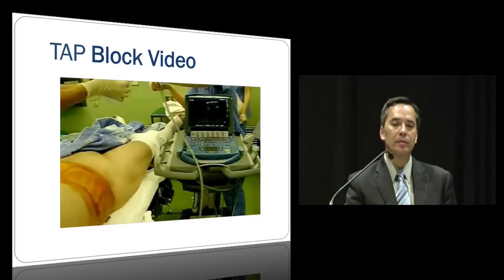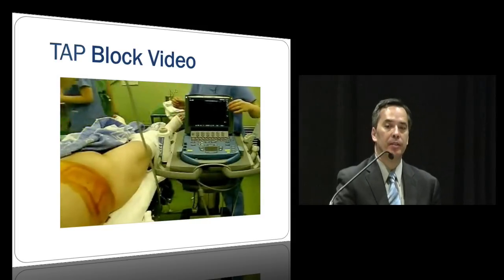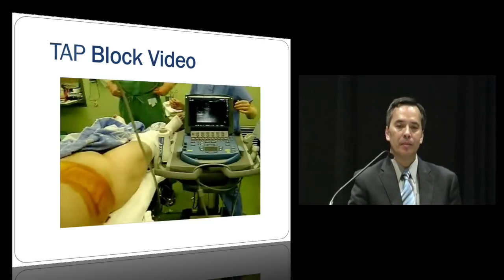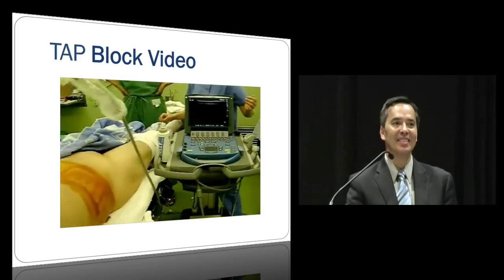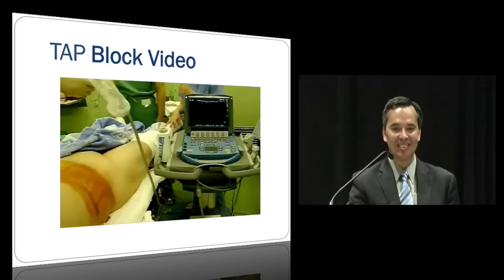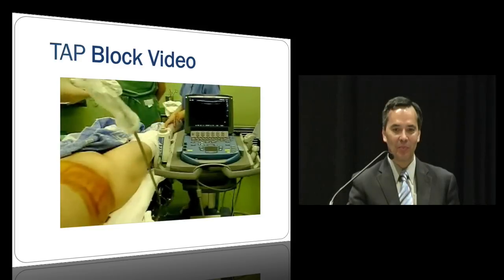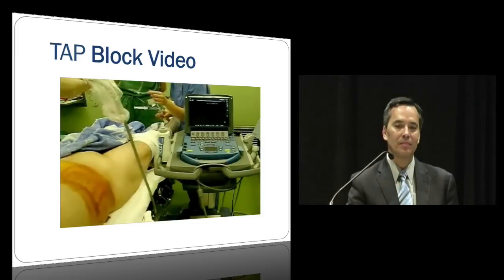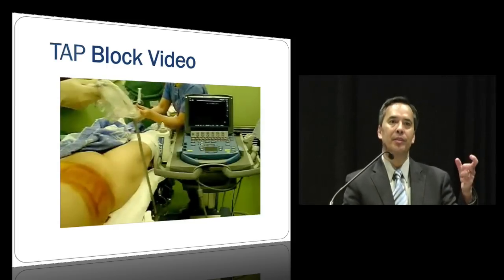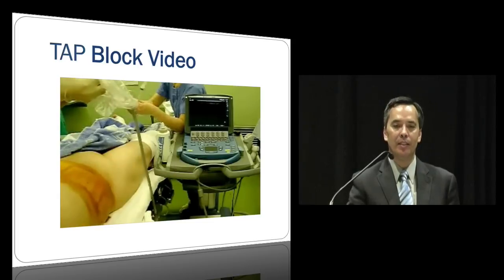So there's the gel. It's going in. And the ultrasound visualizations are pretty good. You can really see it. So there's the government workers in the background. You can see them. So another guy is holding the syringe, and so if you're really busy, you really have to have the time, and you also need the help.